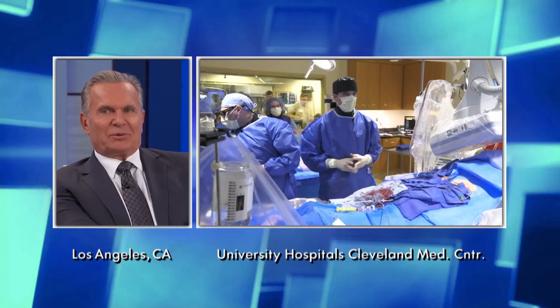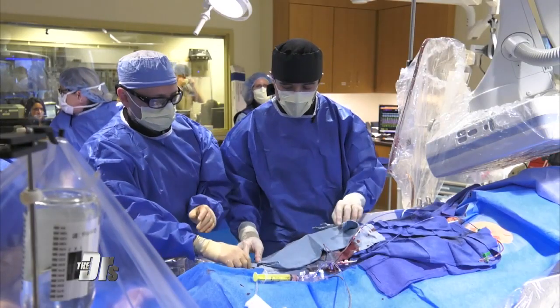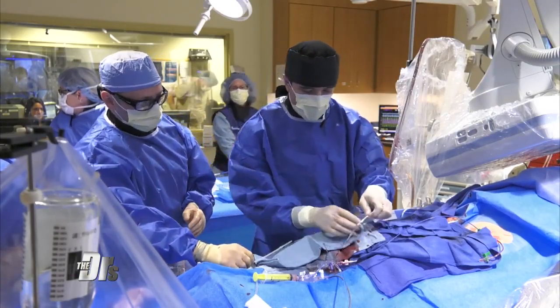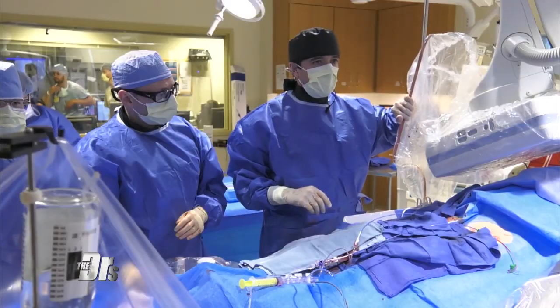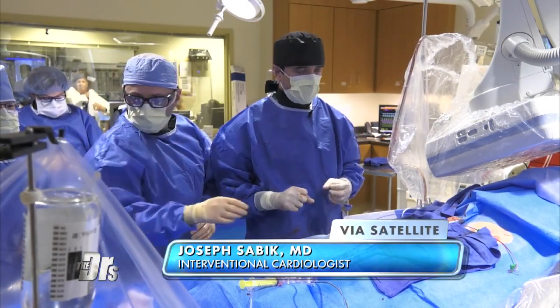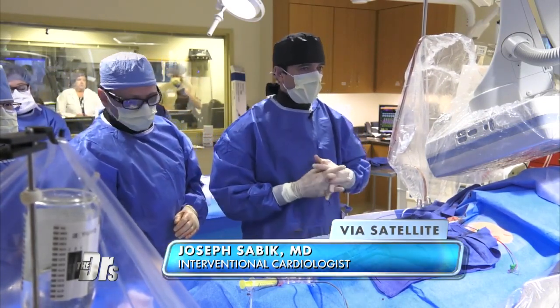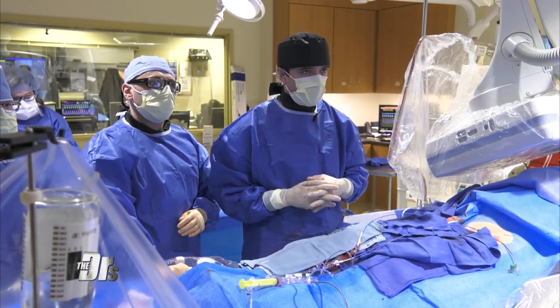I'm sure the big challenge here, doctor, is you have a valve that's a certain size, I guess about 1 inch, but you have to pass that through a much smaller catheter. How do you do that? You're exactly right. The technology that's involved with this is just mind-blowing. It's all how that valve is loaded on the catheter. We call that crimping. And then when the valve is crimped and delivered through the valve, it is then allowed to enlarge and move the old valve out of the way, and the new valve sits in there very nicely.